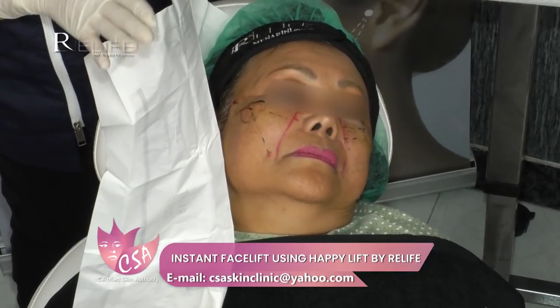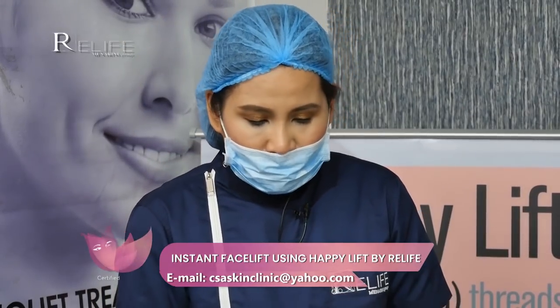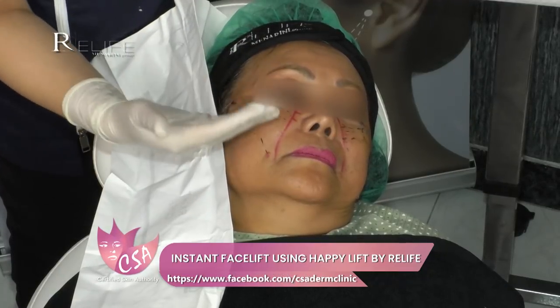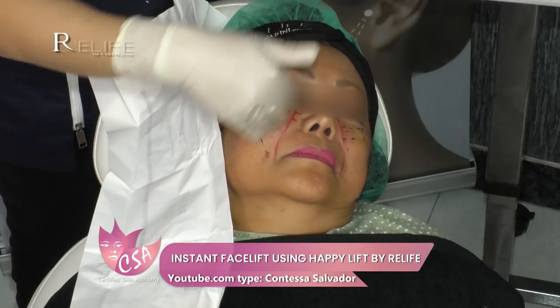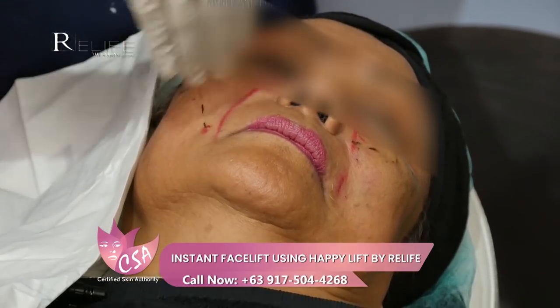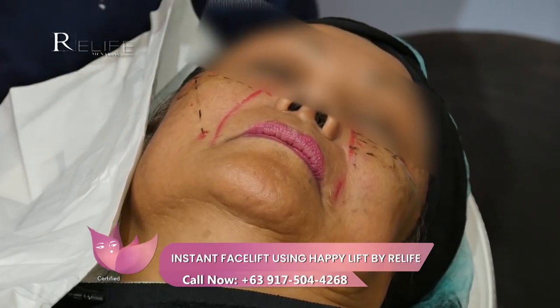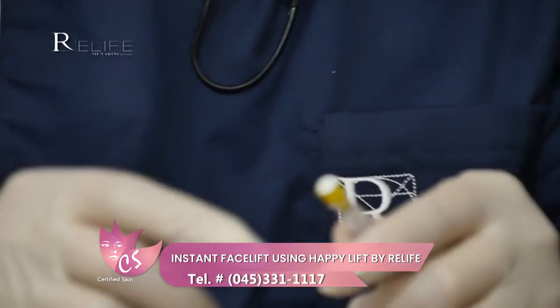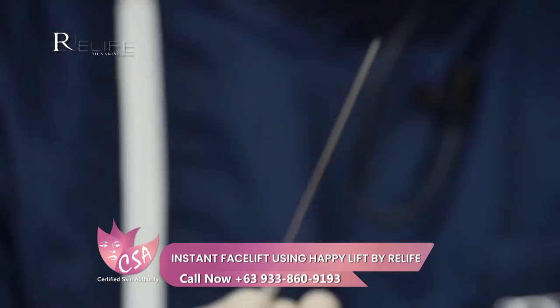In the upper temple region, we want to avoid the superficial temporal artery as well as the temporal branches of the facial nerve. Along the second safety line, we want to avoid branches of the facial artery, which courses through the nasolabial fold up to the lateral aspect of the nose. I'm using again a gauge 19 or gauge 20 needle or cannula needle.